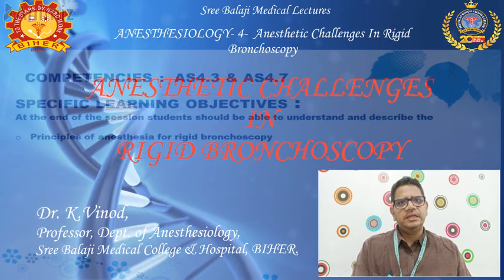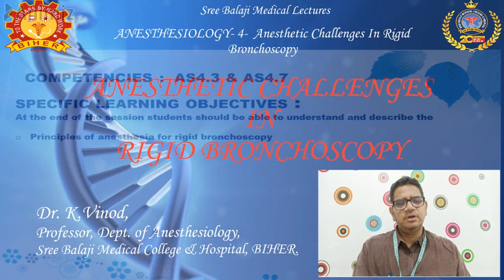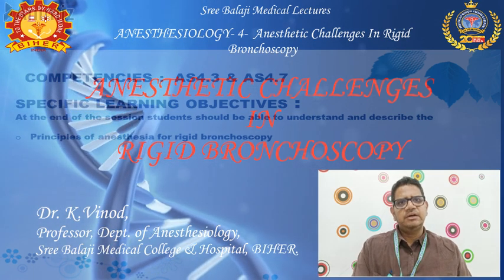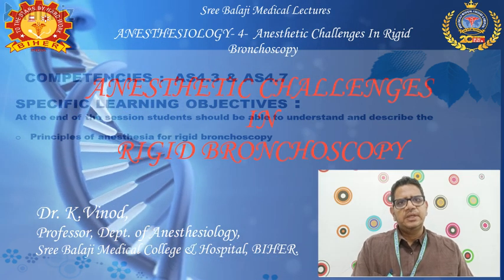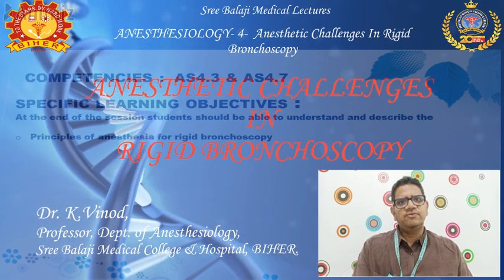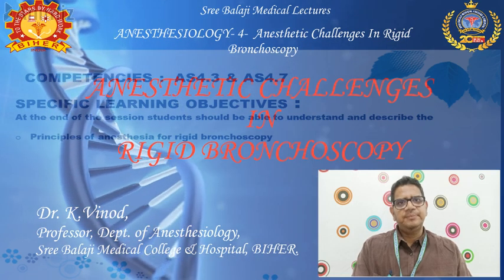Rigid bronchoscopy is a procedure that can be done on an outpatient basis as well as for procedures which take longer duration. So we have to tailor the anesthesia according to the needs of the rigid bronchoscopy. Additionally, a rigid bronchoscopy is a procedure in which the definitive airway may not be established, which leads to a lot of trouble for the anesthetist in anesthetizing them safely.